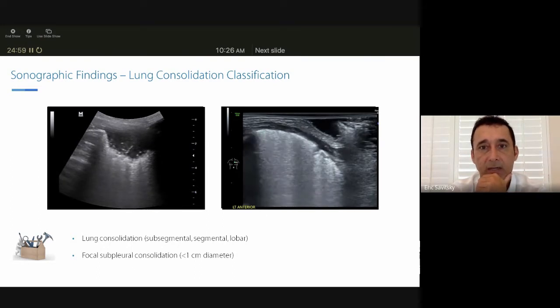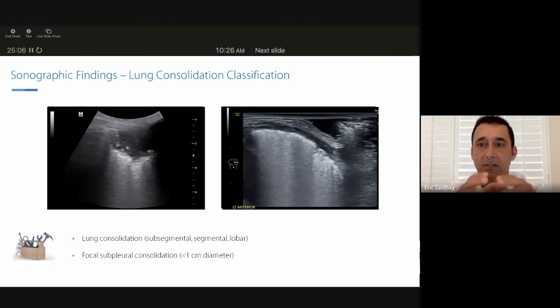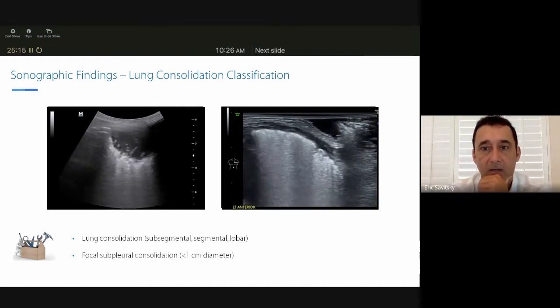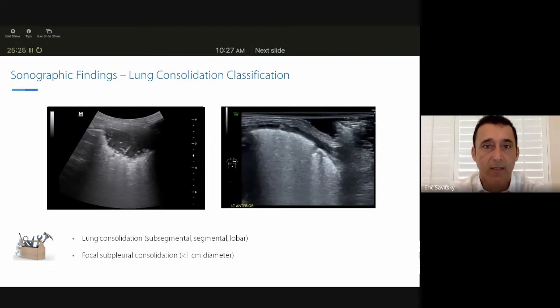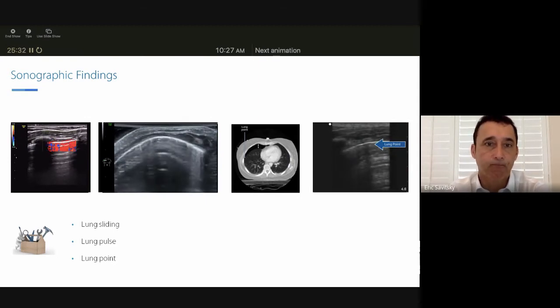And then here you see some irregularity of the margin, and then a hyperechoic signal below it. And this has been termed a shred or fractal sign. So this is a subpleural consolidation that's accompanied by an irregular deep border of consolidation and aerated lung. Once again, that sign is called a shred or fractal sign, very commonly seen with subpleural consolidations that are very often seen with viral pneumonias. COVID-19 has been one of those where this is a very commonly seen lung finding.